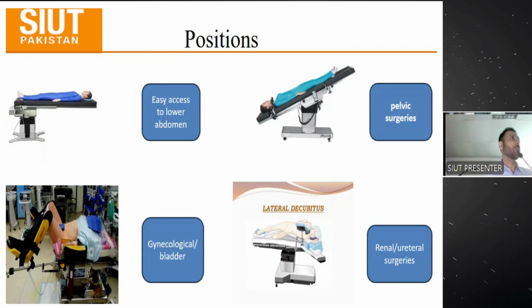And the most common that the urologists use is the lateral decubitus position, which is used during the renal and the ureteral surgeries.